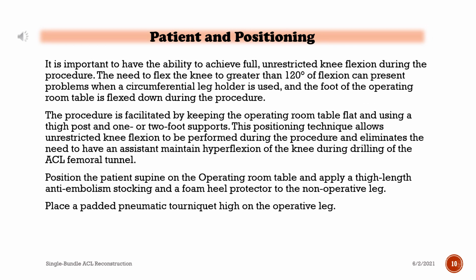It is important to have the ability to achieve full, unrestricted knee flexion during the procedure. The need to flex the knee to greater than 120 degrees of flexion can present problems when a circumferential leg holder is used, and the foot of the operating room table is flexed down during the procedure.